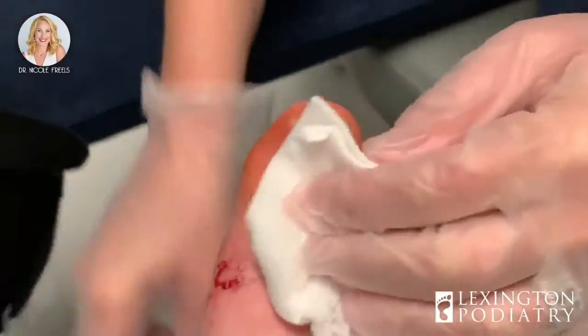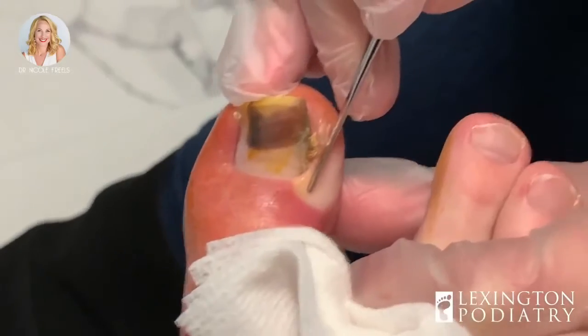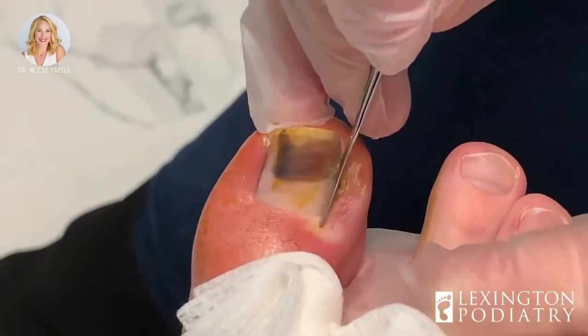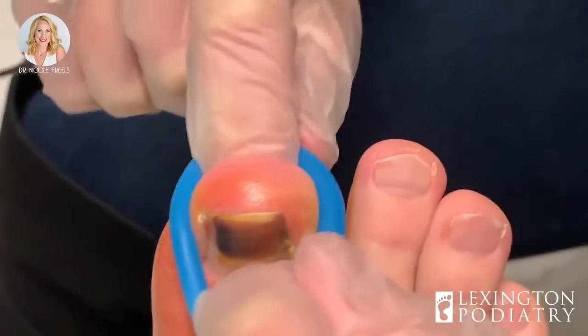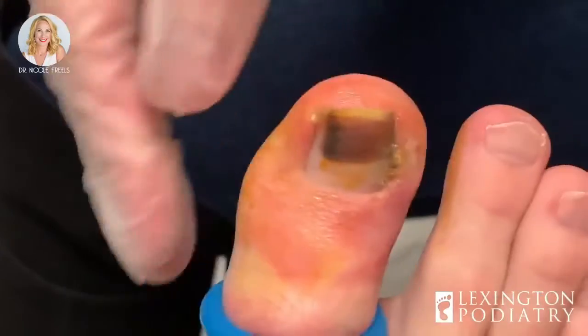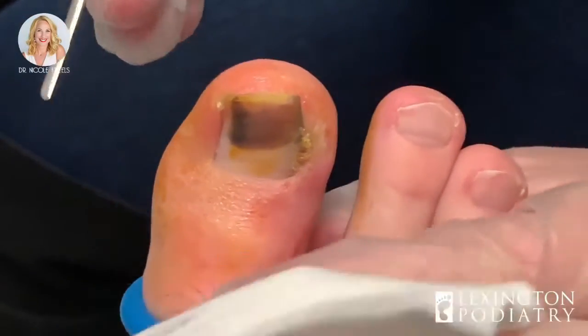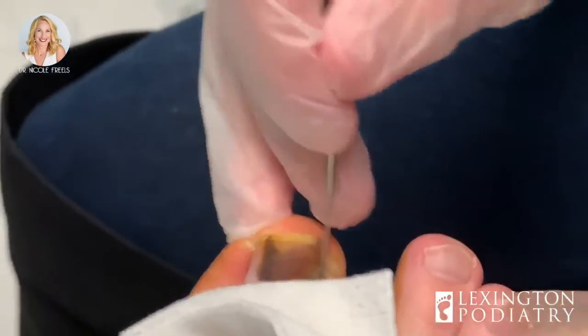All right. Now let's check it again, and that's why I check this a lot of times before we go straight in, to make sure. Anything at all? No. Wonderful. So pressure's okay, no pain. Would you like to watch? Probably not. Okay, you were peeking over the gauze. I think that's maybe why I was like, okay, this should be hurting, but it's not. Right, okay. I saw the look on your face.